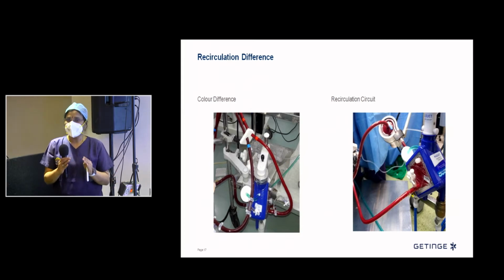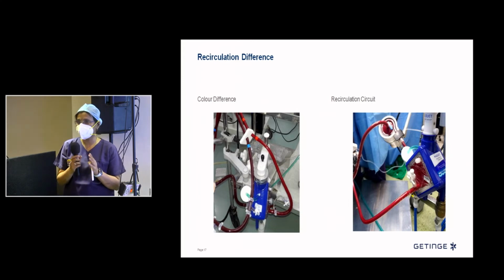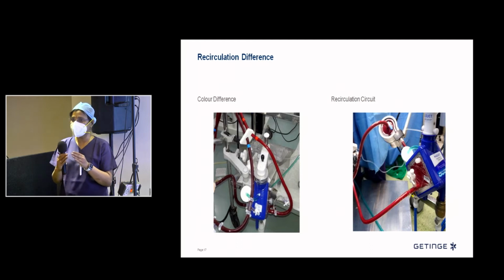Subclinical recirculation, what we need to do is 2-3 things we can do practically. One is, every day morning we have to see a pre-oxygenator gas, pre-oxygenator ABG, and trending pre-oxygenator saturations gives an important clue. Like for example, you are starting with a 60% saturation on day 1 of ECMO. I am telling a pre-oxygenator, not the central venous saturation of the patient. So pre-oxygenator you say 60%. It's increasing, 65, 70, 75, 80.